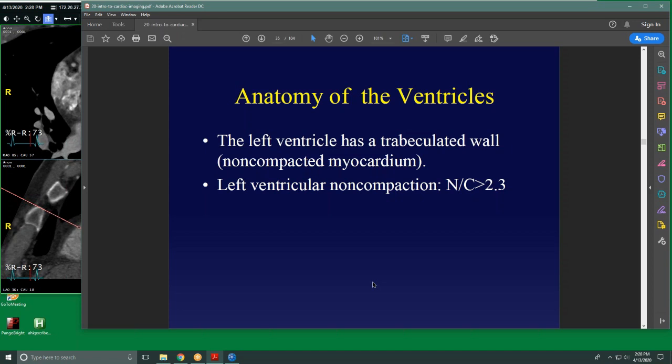And there are other times as well, like we do what are called TAVIs. Have you guys heard of TAVIs for the aortic valve? That's where they put an artificial aortic valve in there. We'll actually acquire during the entire cardiac cycle, see how the valve moves, and look at the maximum valve area, aortic annulus area. There we do an intentional acquisition and reconstructions for the entire cardiac cycle. But the acquisition, we still call it gated, right? Because your reconstruction is based off the EKG, retrospective. It's a retrospective reconstruction off of the EKG. So it's kind of an awkward term in that regard, but that's what it's used for.